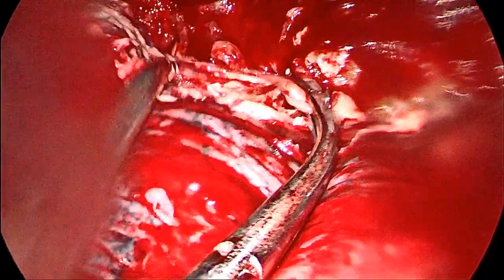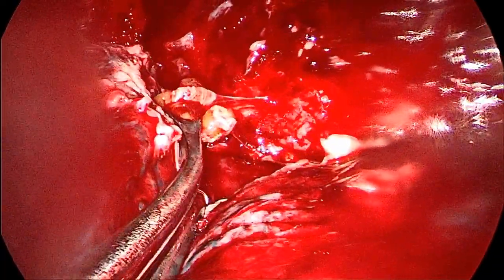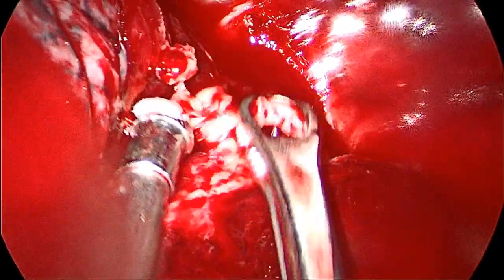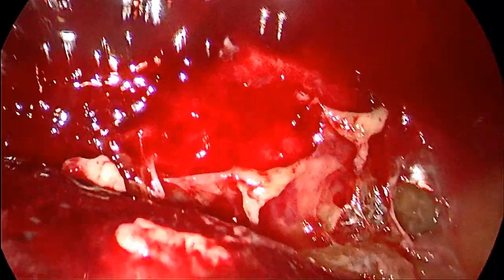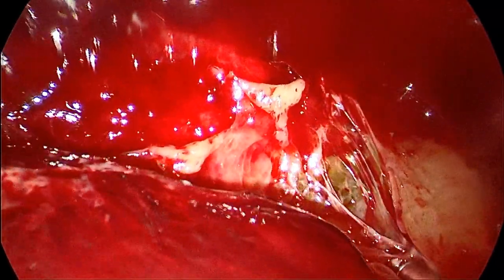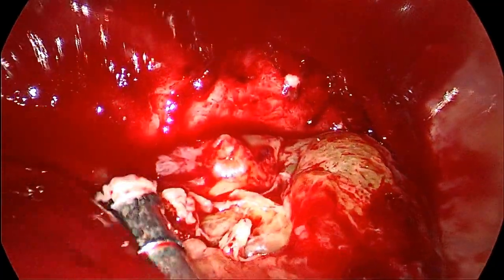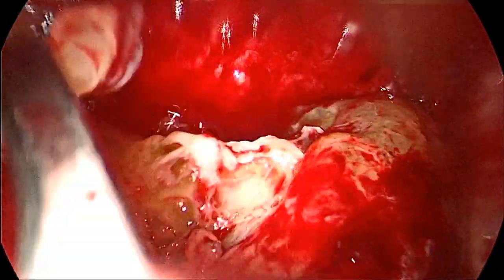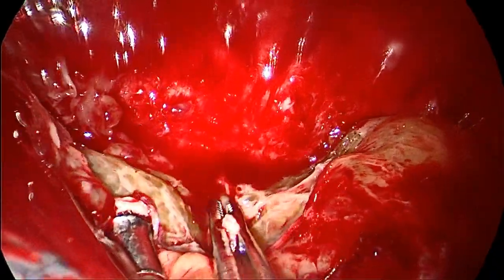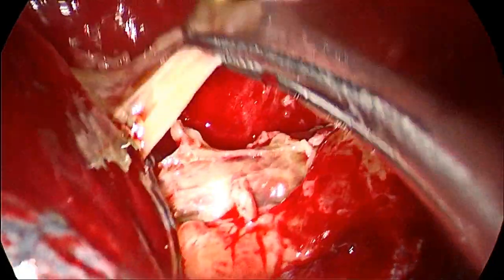In some areas, you will find small parts of thick pleura that are carefully swept away from the lung. Care should be taken to remove all the biofilm and adherent material, as most of the time this is an organized collection that antibiotics cannot reach.